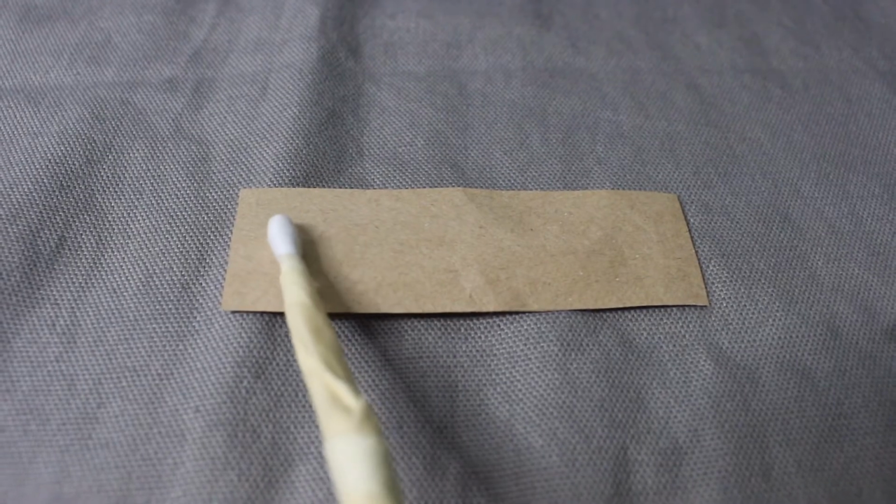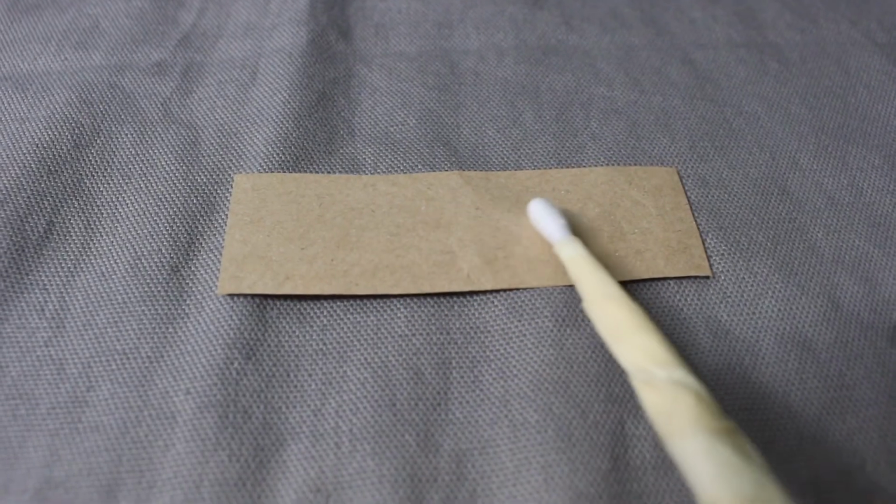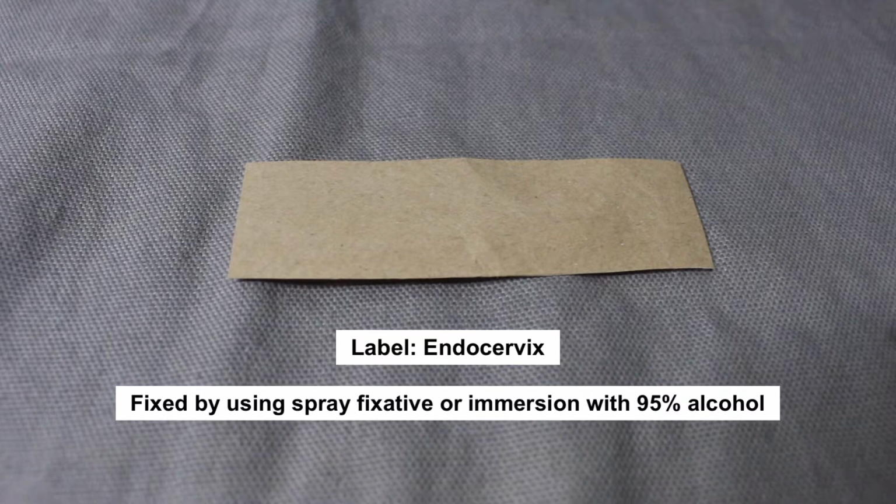The material obtained is then smeared thinly on a microscopic slide by rotation of the swab or brush on a glass surface. This is labeled endocervix and fixed immediately either by using a spray fixative or by immersion of the slide into a fixative solution.